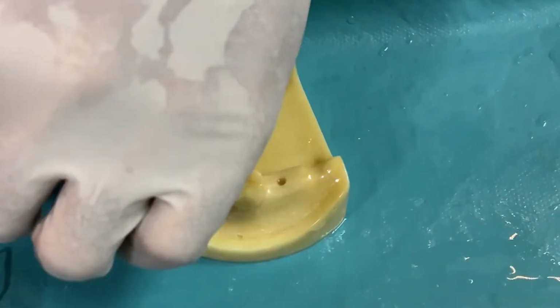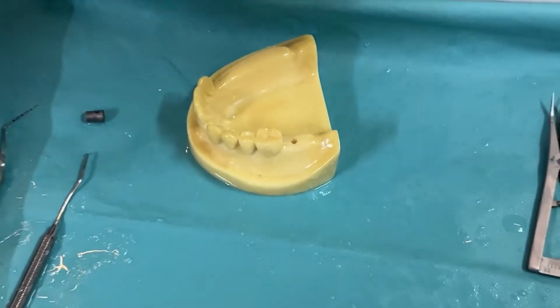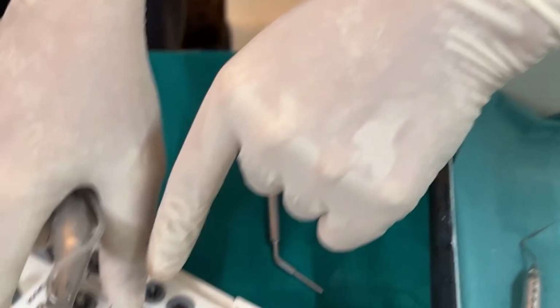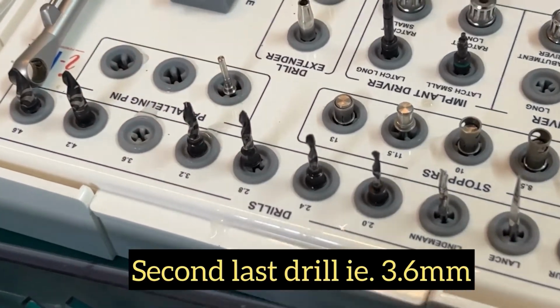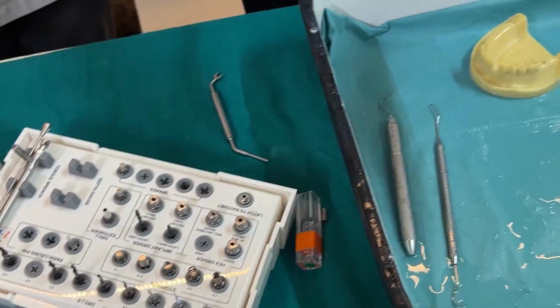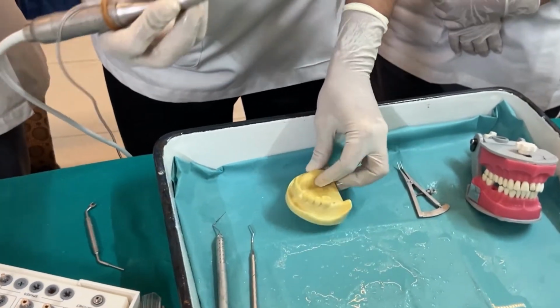Now we move on to the next drill. This drill we can just focus upon. So we have covered till 3.2 right now, and we are moving on to the second last drill, that is 3.6, and after this it would be the last drill, which is 4.2, right, for a 4.5 millimeter implant.